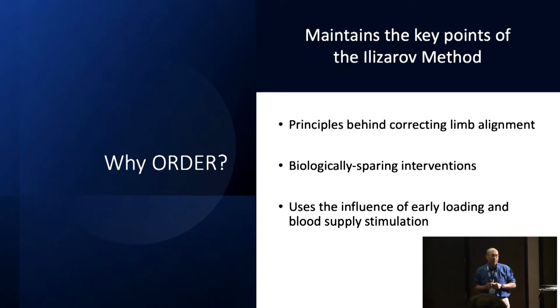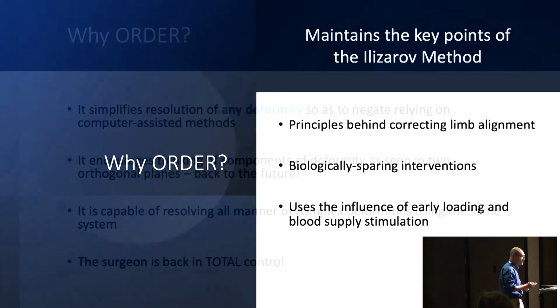So the key thing I want to credit about the technique as it evolved is we did not forsake the principles of the Ilizarov method. So keeping the biology, doing the deformity analysis as you have been taught in the last 4 days, and importantly, post-fixation, choosing the methods of stabilization that will allow early functional loading. One of the advantages of using an external fixator is that you can facilitate early functional loading. So if you're going to substitute internal fixation, you do not want to lose that important advantage.